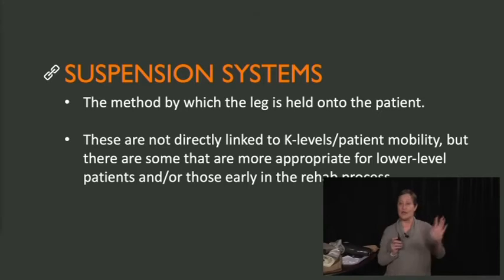Okay, now that's all the stuff that leads up to suspension. Now we'll talk specifically about suspension system. So again, it's pretty straightforward. Suspension system is the term used for how a prosthesis is held onto the body.